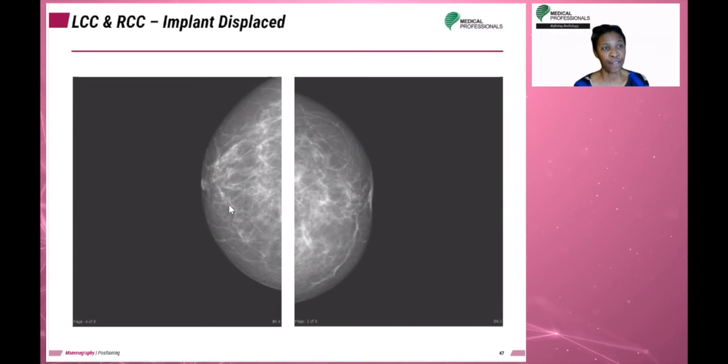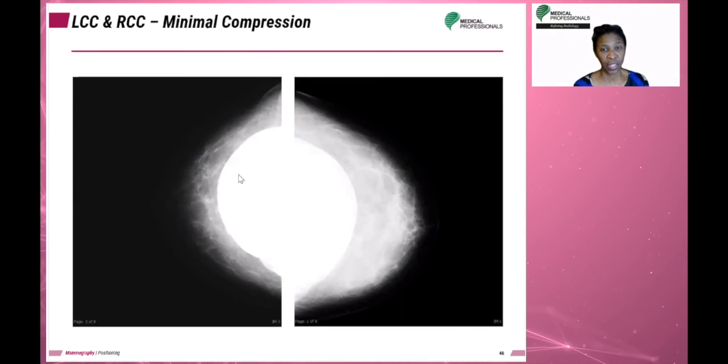But of course, if you are not working with digital, or if you don't have enough breast tissue covering any portion of the detector, then you need to set manual technique, especially if you are not actually over the breast tissue, because you will give the patient an overexposure. Although, yes, with digital, it will correct. You'll see a good image unless you go too far over, but you are giving that patient an overexposure. And remember with breast imaging, the patient is coming yearly for their mammograms, so you don't want to give them an overexposure unnecessarily.